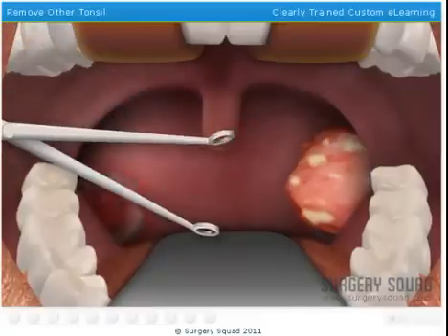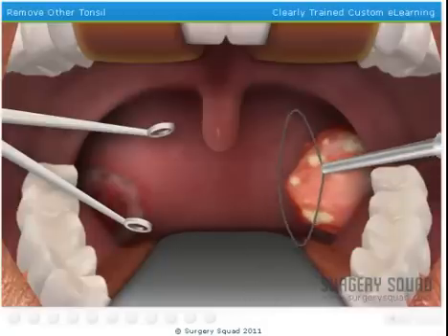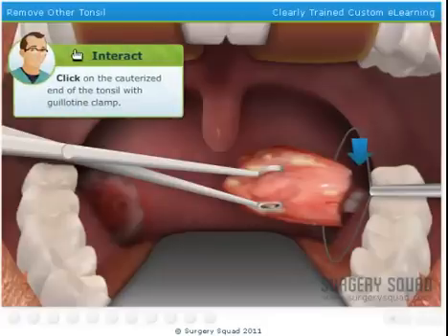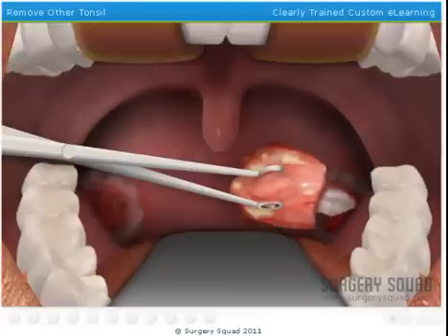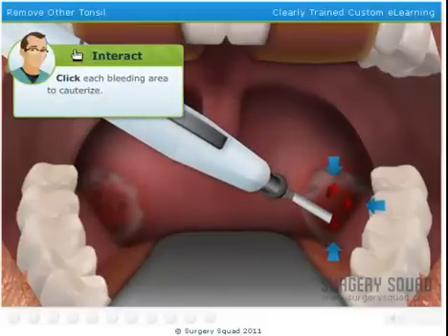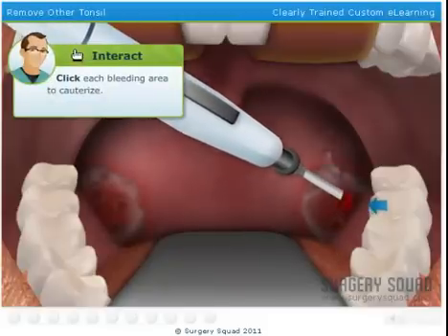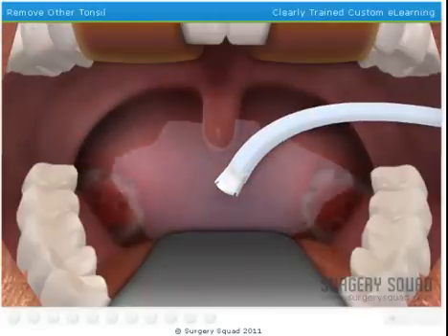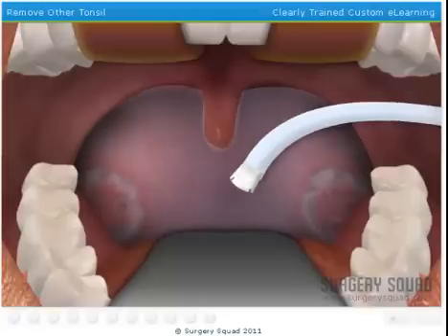And finally we need to remove the tonsil. I'll clean out the mouth with some irrigation and suction, and then we're all done.